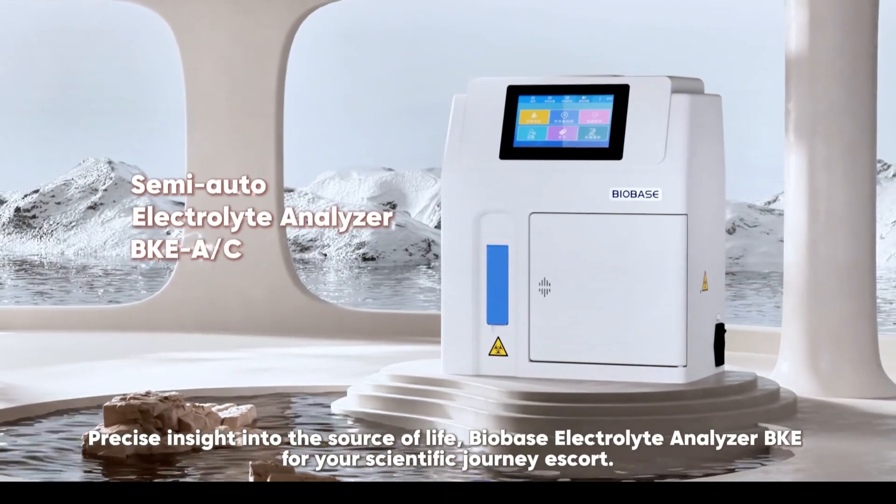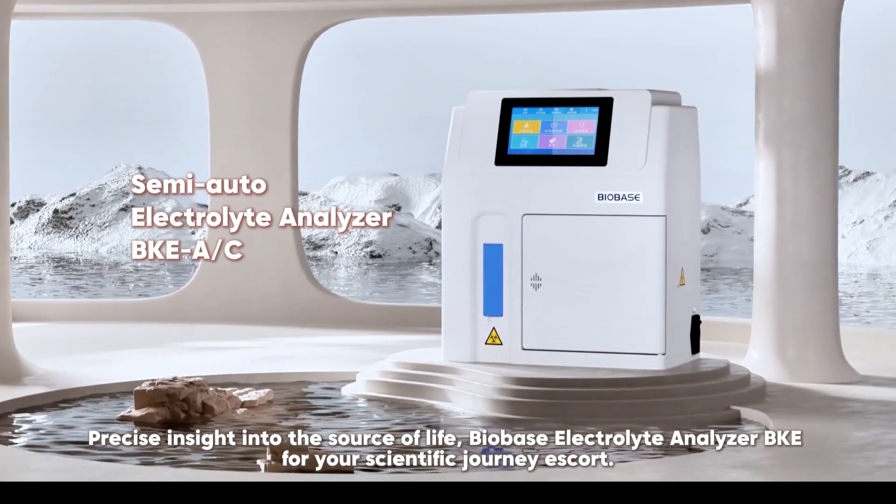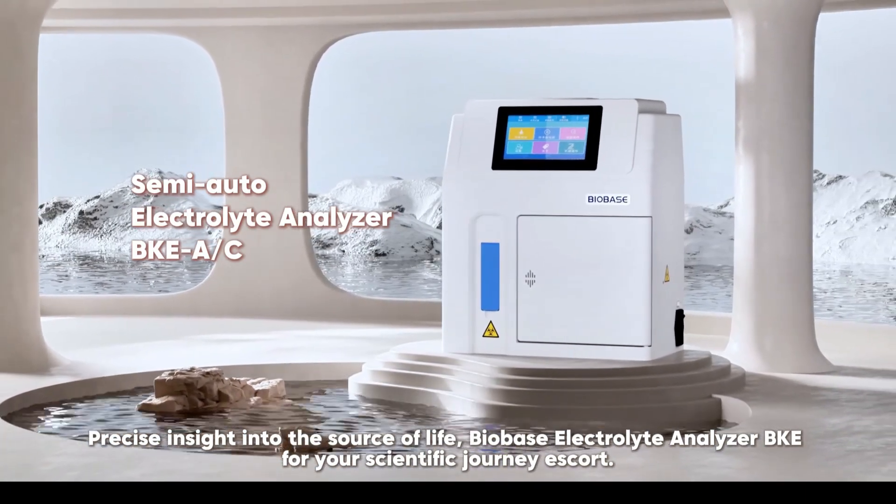Precise insight into the source of life. BioBase Electrolyte Analyzer, BKE, for your scientific journey escort.